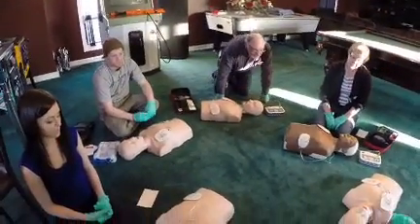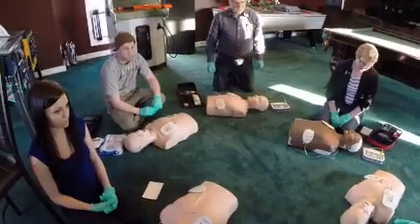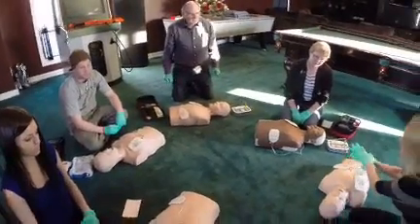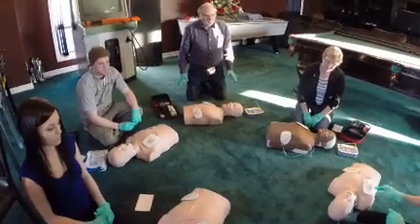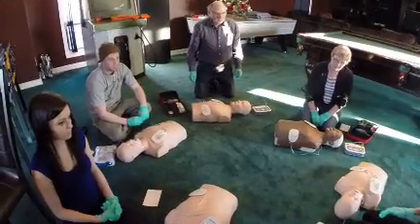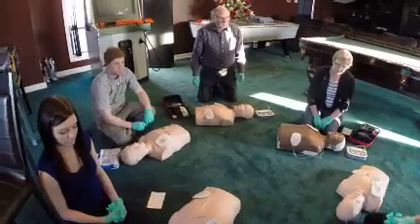Right, yeah. And the nice thing about this, you hear that ticking sound? So it's going to help you with doing your compressions. That is your rhythm. Give 2 breaths. And this one in particular will tell you to give the 2 breaths.